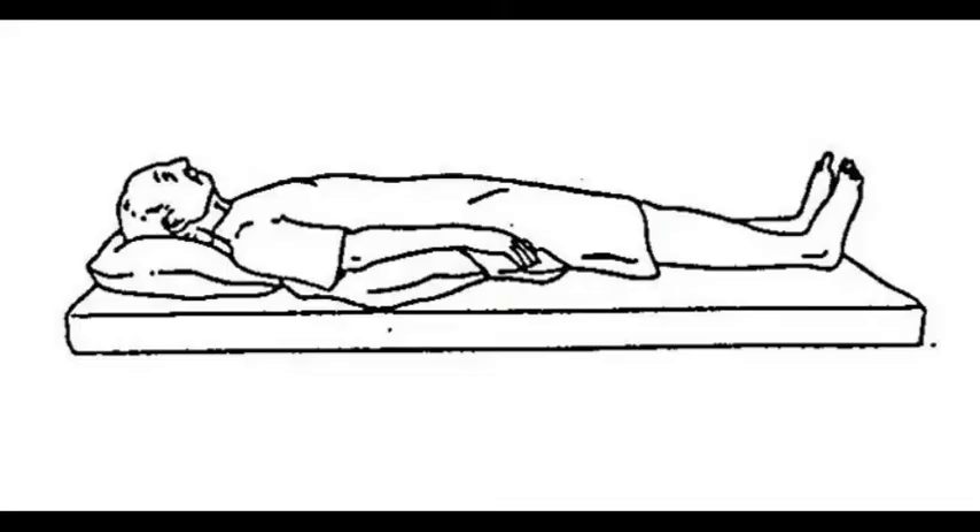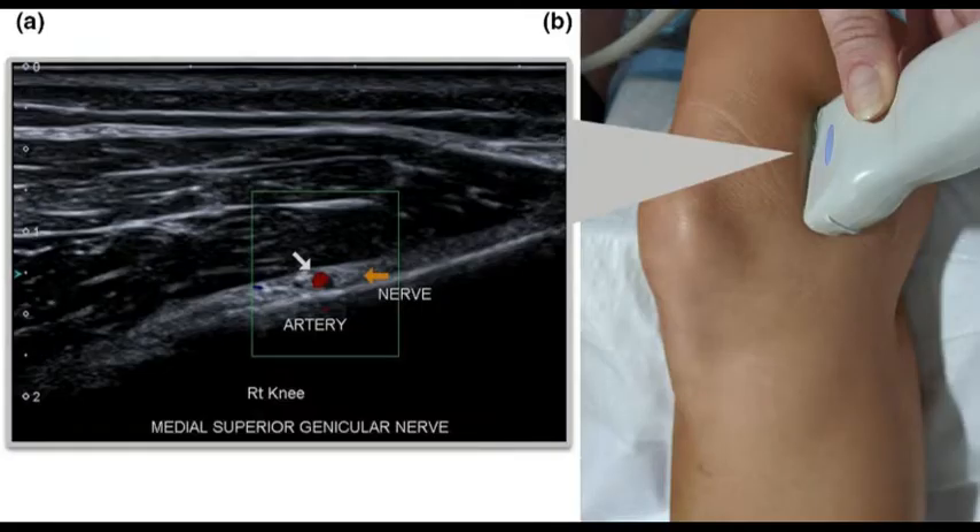For patient positioning, the patient is placed in the supine position. The ultrasound landmarks are the osteomuscullar planes at the level of the metaphysis. Additional landmarks are the corresponding genicular arteries, which follow the same path as the nerves, and the collateral ligaments.